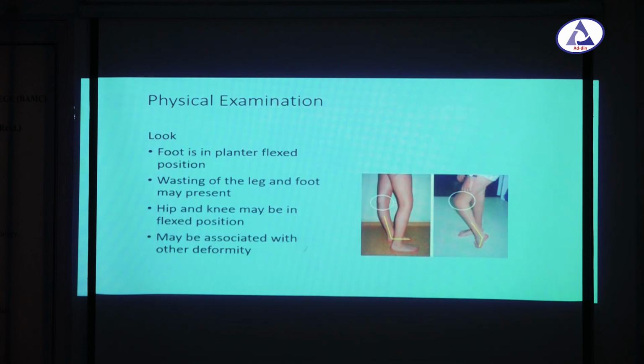In physical examination, on looking you can see the foot is in plantar flexed position, and there may be wasting of the leg and foot muscle, and the hip and knee may be in flexed position. In this image you can see one is from the lateral side, one from the medial side. In both cases the foot is in equinus position and there is some flexion of the knee joint.